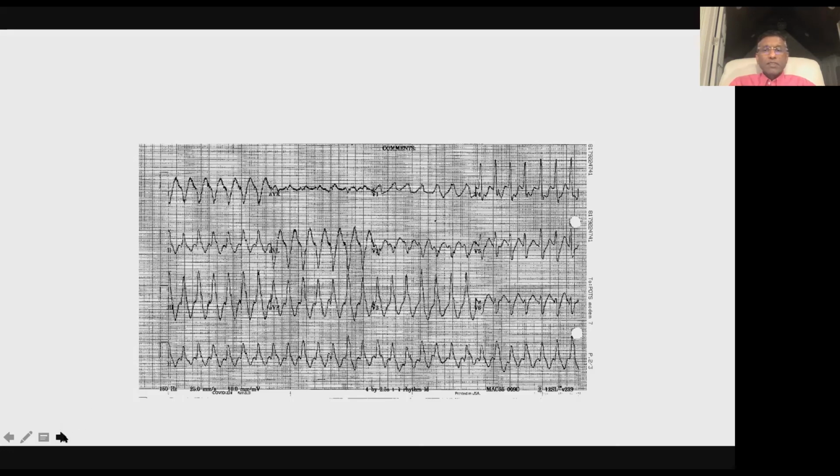Actually, you have these types of patients, so you should look at one of these. This is a patient of mine with sarcoid who came to ER with this rhythm. She fainted a couple of times at home and then came in. I'm going to just walk through it quickly for purpose of time.